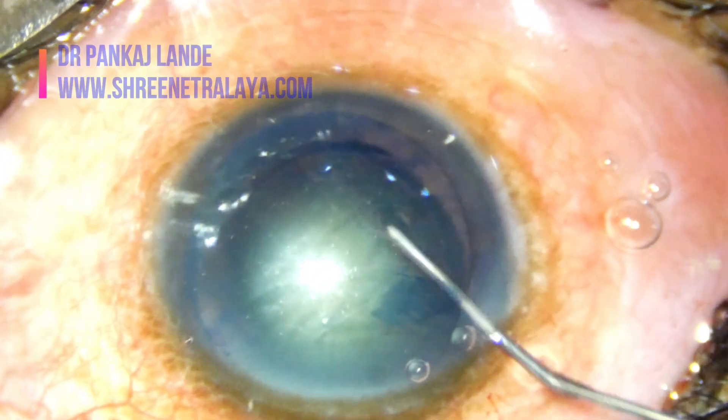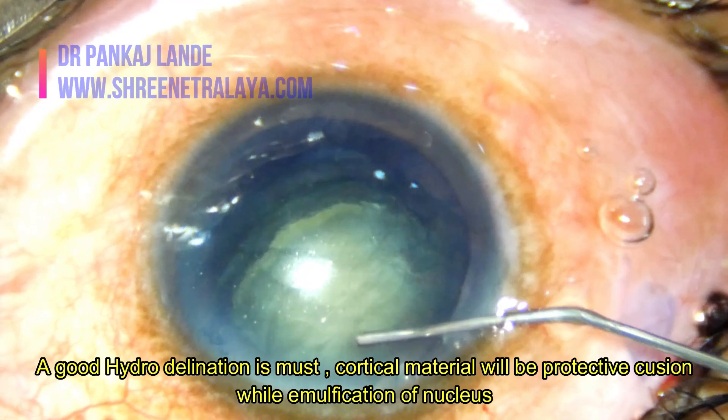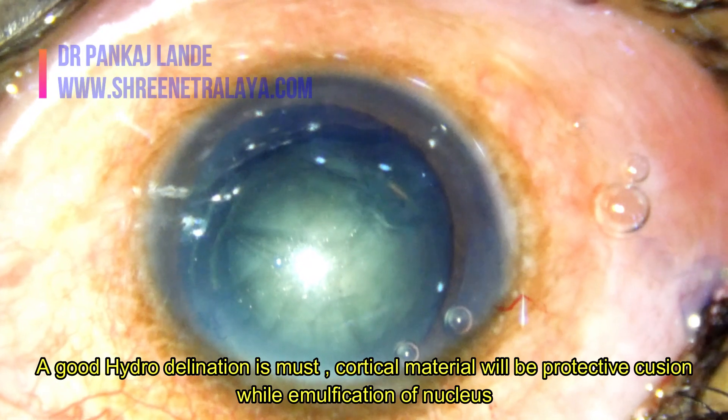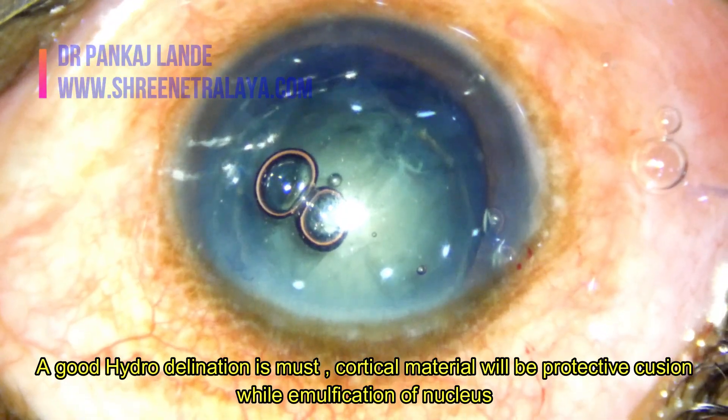Do a good hydro-delineation so as to have the epinuclear plate and cortex as a cushion for the posterior capsule. This will prevent any injury while performing phacoemulsification.